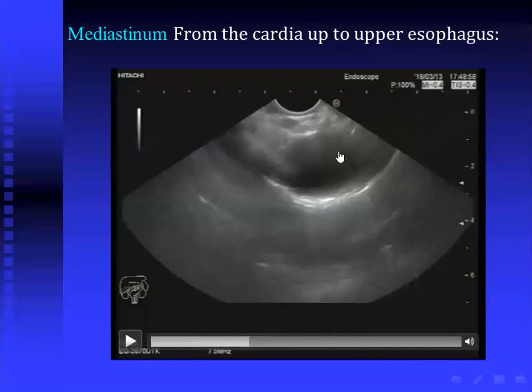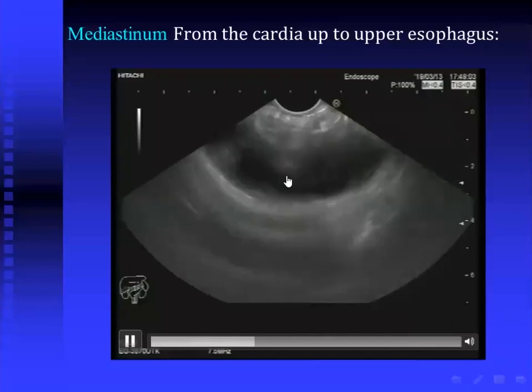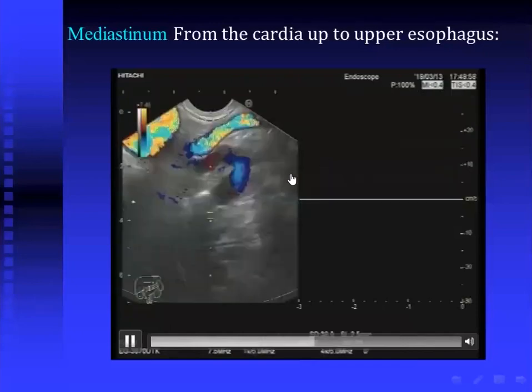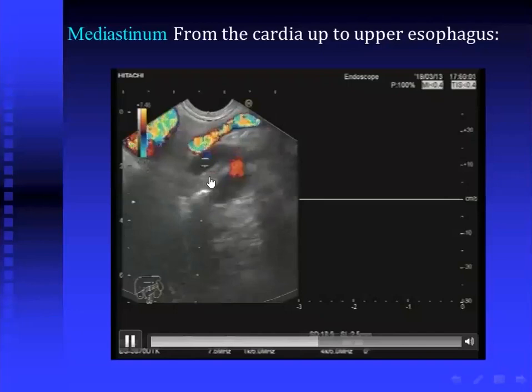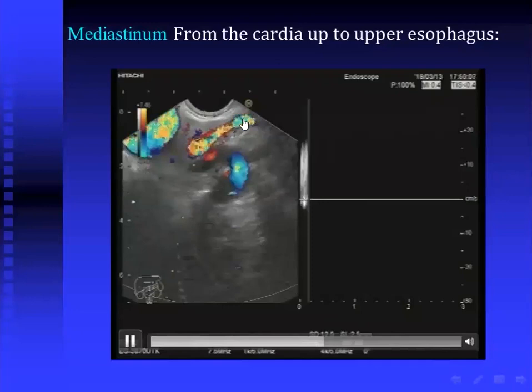This is a big ear of the Mickey Mouse, and this is another big ear. And here in between is area 4L, 4L, and 5 more deeply, and 6 behind the aortic arch, and here station 10 left. Okay, so this is a Mickey Mouse appearance, very nicely seen. 4L, 4L, 5, 6, and 10 left. Yes, and I can here confirm by pulsed wave Doppler at that structure. Yes, it is arterial, very nice.